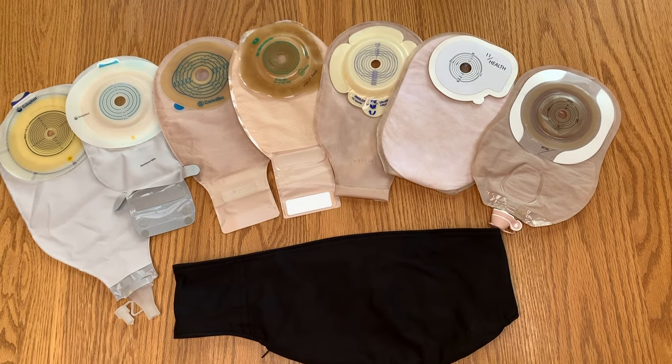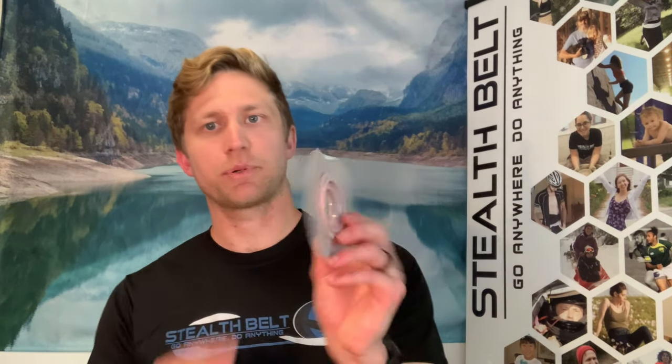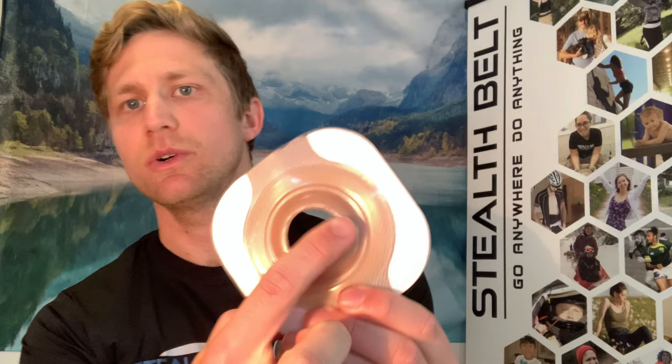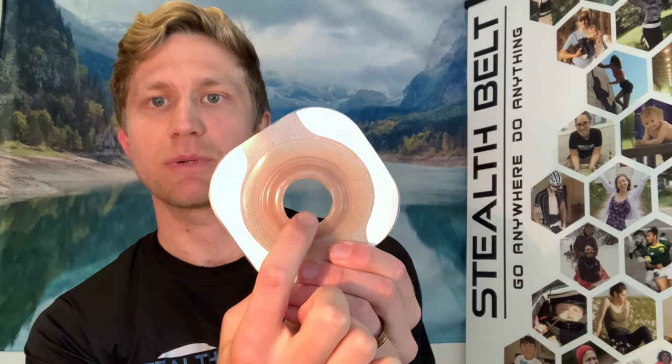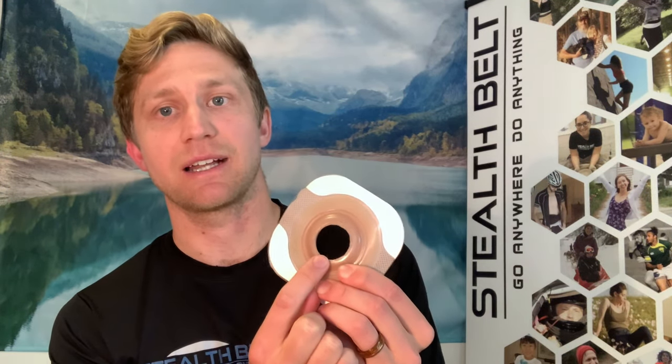The fourth leak prevention tip is making sure you've got the right appliance sized properly for your particular stoma. Many appliances come pre-cut, which is convenient, but you have to be careful that the hole isn't too big. From my experience and research, the hole should be as close to the size of your stoma as possible. If there's more than about a centimeter of space between the stoma edge and where the adhesive starts, you're setting yourself up for leaks — consider adhesive paste to fill that gap or manually cutting the hole yourself.